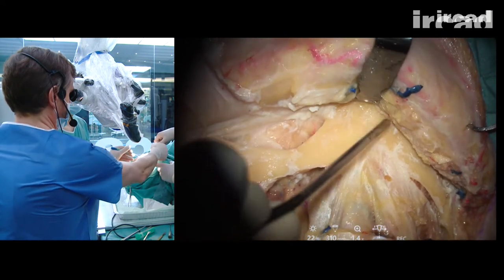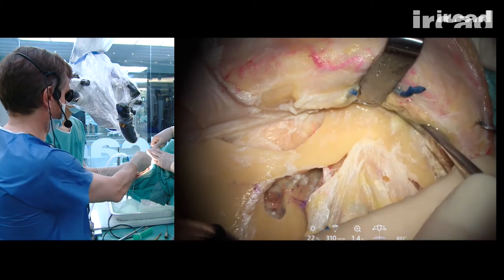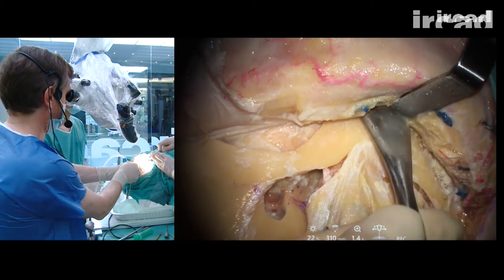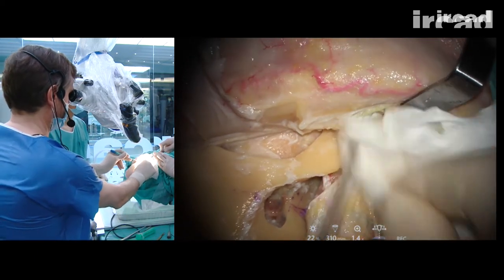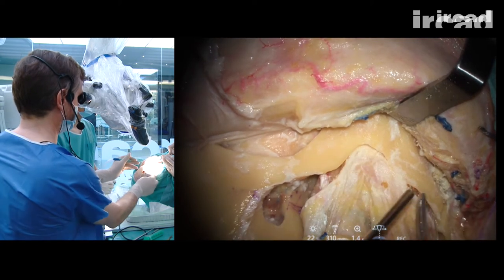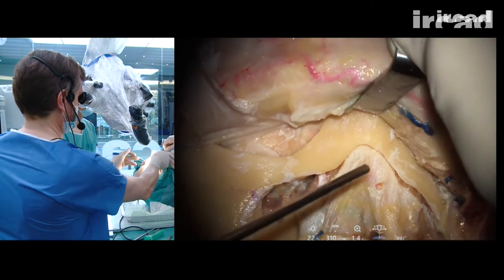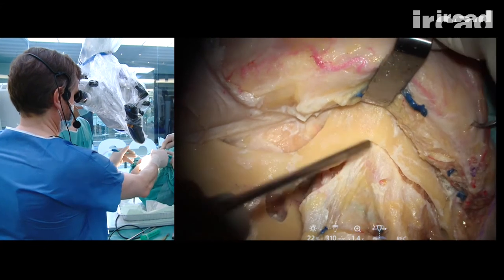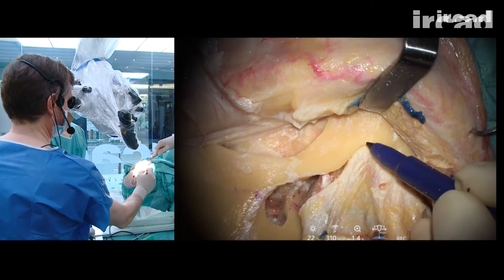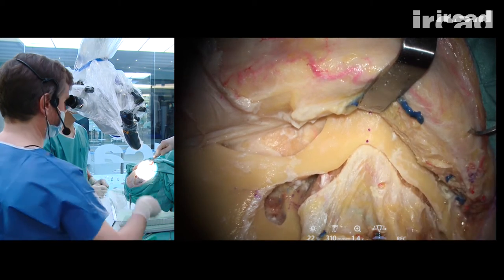So you need at least 1 centimeter of exposure. Là. Not more than this, otherwise, if you cut more than 1 centimeter from the angle here between the frontal process of the zygoma and zygomatic arch, you may enter at some point into the maxillary sinus. Lâchez. Okay. So from here to here, 1 centimeter is a good distance, not more than this. If it's too short, this will break at some point.